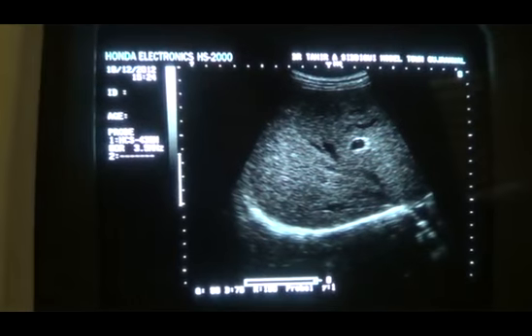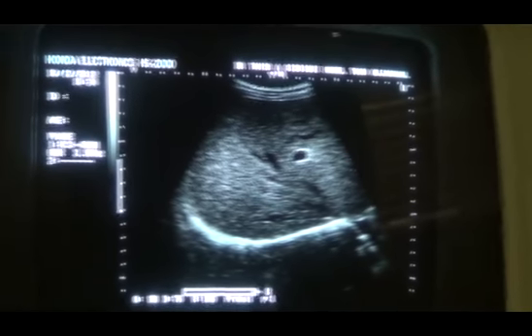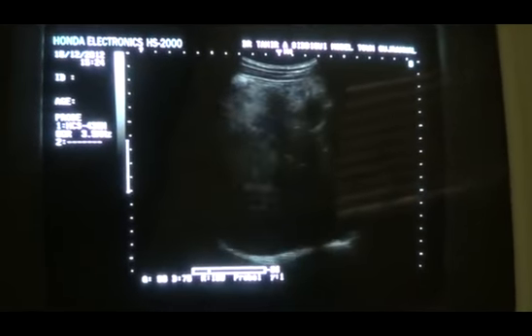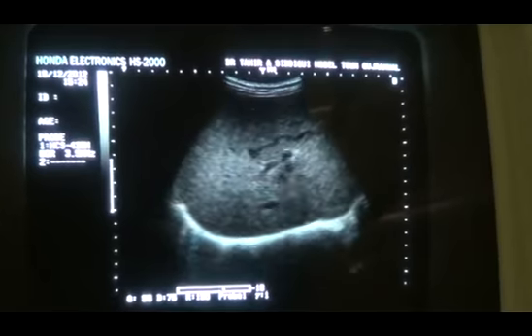So this is a study of a normal liver, because until and unless we are well acquainted with what a normal liver looks like, we will not be able to differentiate it from the pathological liver. Thank you.